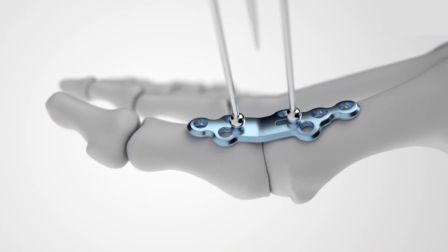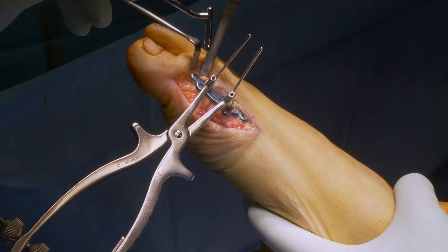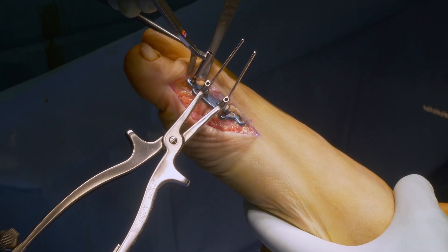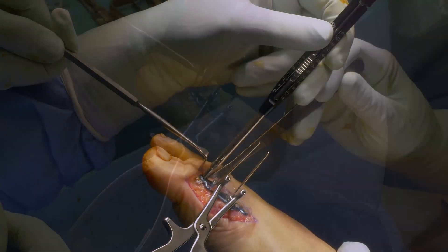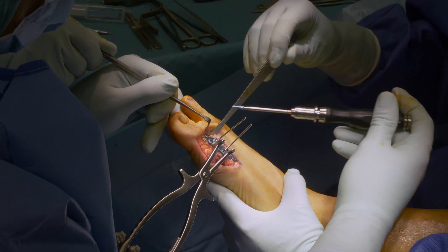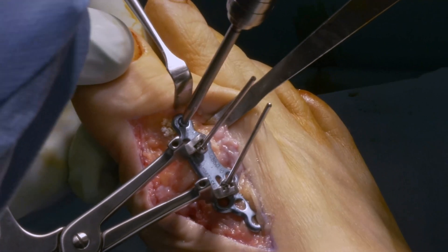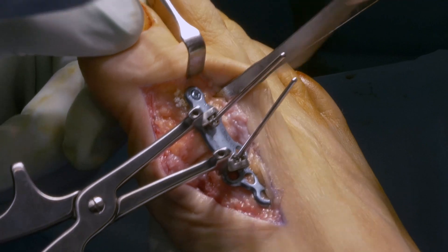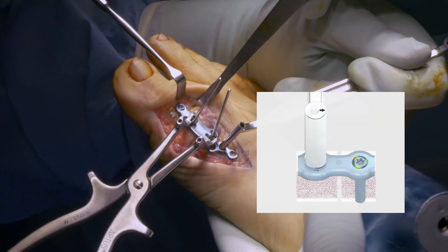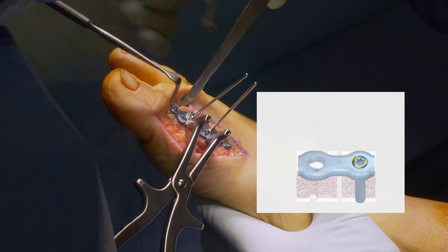With the olives and the compression forceps, compression can be applied to close the joint. Check the position of the arthrodesis with simulated weight bearing under the implant container lid. Start with a distal hole to fix the plate and determine the corresponding length. Insert a 2.8 multidirectional Triloc screw. The Triloc plus hole can be used — an eccentric hole is drilled to achieve compression of about 1 mm with multidirectional locking.